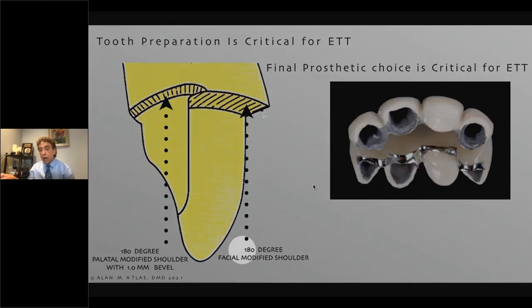In this case, I used a PFM. I put a bevel here, bevel here. This was a vital tooth. I did not need a bevel. I had plenty of ferrule. I manufactured an additional ferrule here. And again, if I didn't have any core here, I would still manufacture a bevel. If I'm using a molar and there's no decoronation, I'm going to put a bevel 360 degrees around.